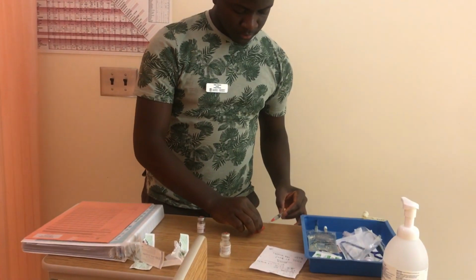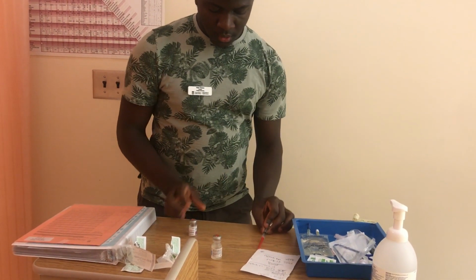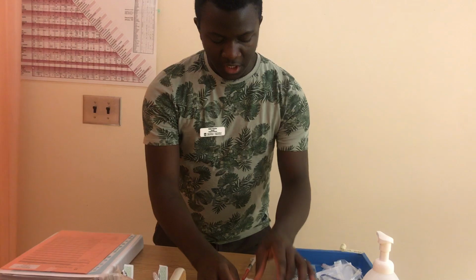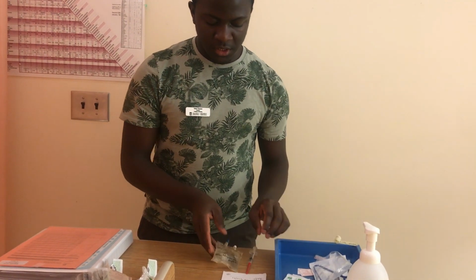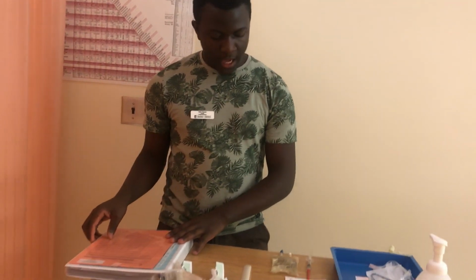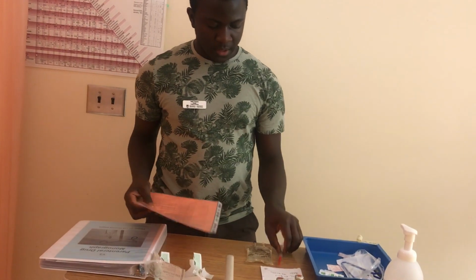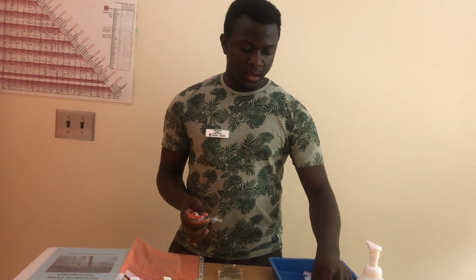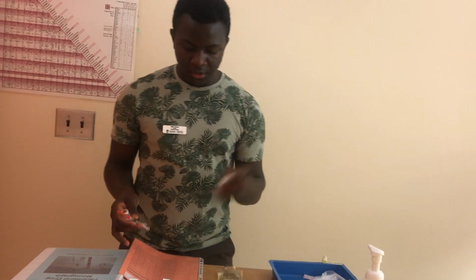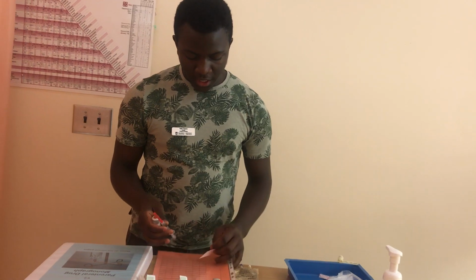And I have 1.2 milliliters here. Okay, so I have my medication. Before I go ahead and dilute it with my normal saline, which is my diluent for this dose, I will do my second check. So I'll get my medication, my vial, and before this I already made my medication label, so I will use all this to do my second check.